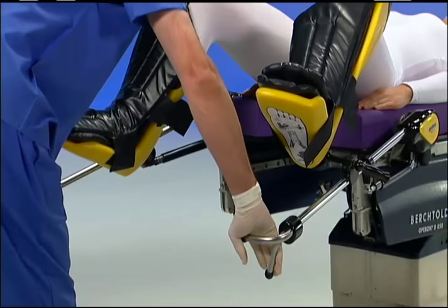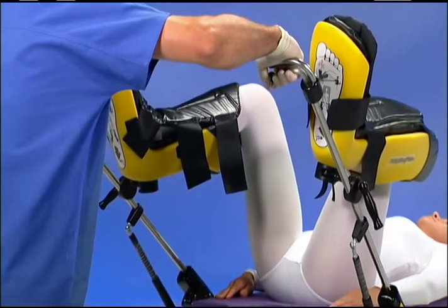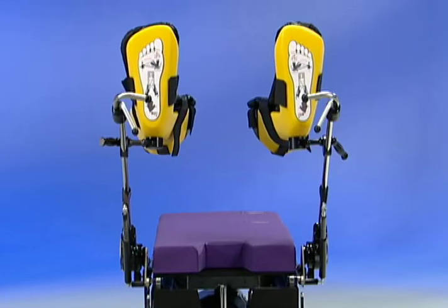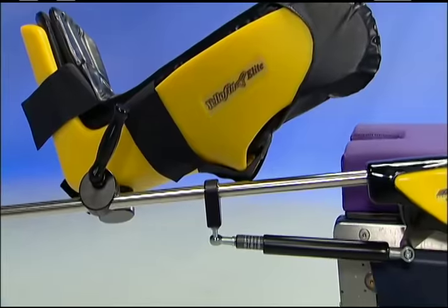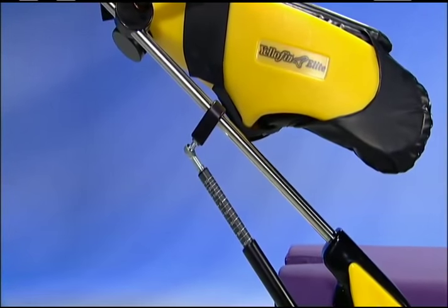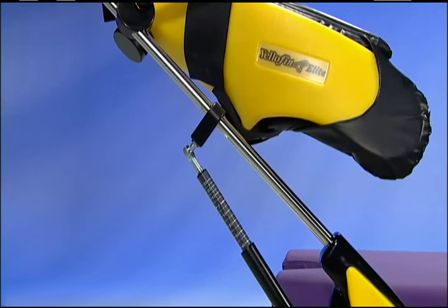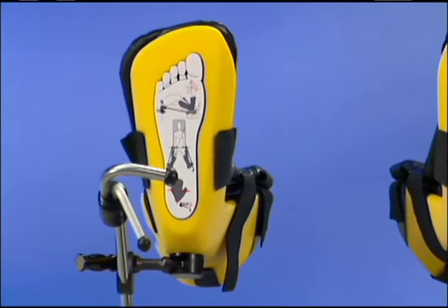The leg holders may be easily manipulated prior to surgery and intraoperatively for procedures requiring repositioning. This in-service presentation will primarily feature the Yellowfins with the lift assist option. The lift assist option is an integrated hydraulic that neutralizes the weight of the leg, making elevated lithotomy adjustments easy and reducing the chance of personnel lifting injuries. All stirrups are clearly labeled for patient left and right.